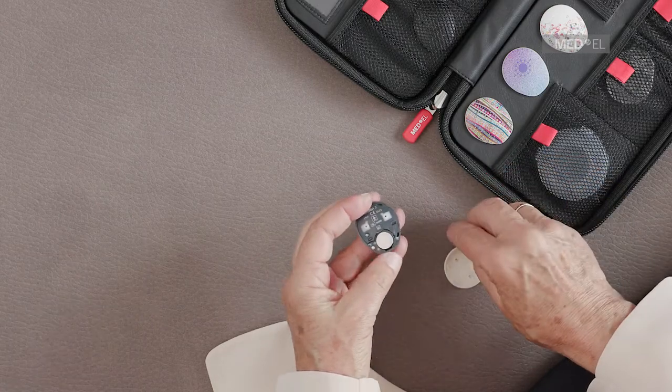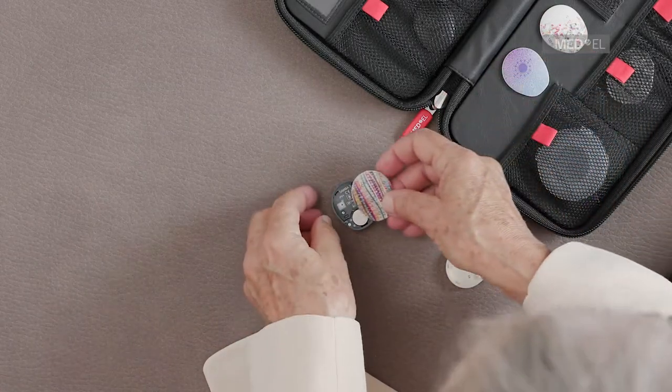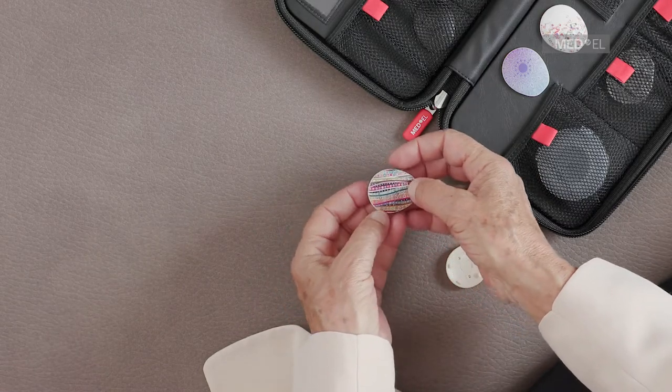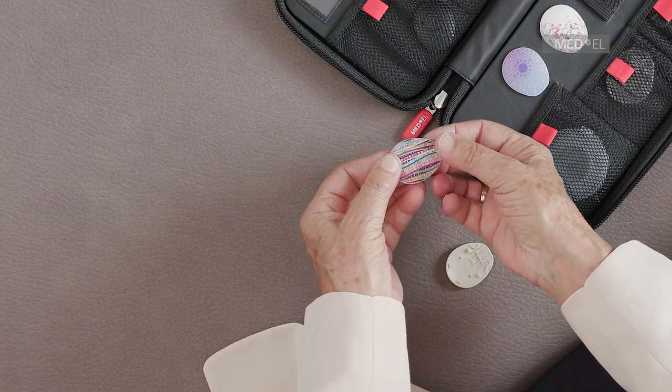Position the new cover over your Samba 2. It is important to snap the cover in place in two steps. First, press down on the side furthest away from the battery compartment, and then on the battery compartment side.